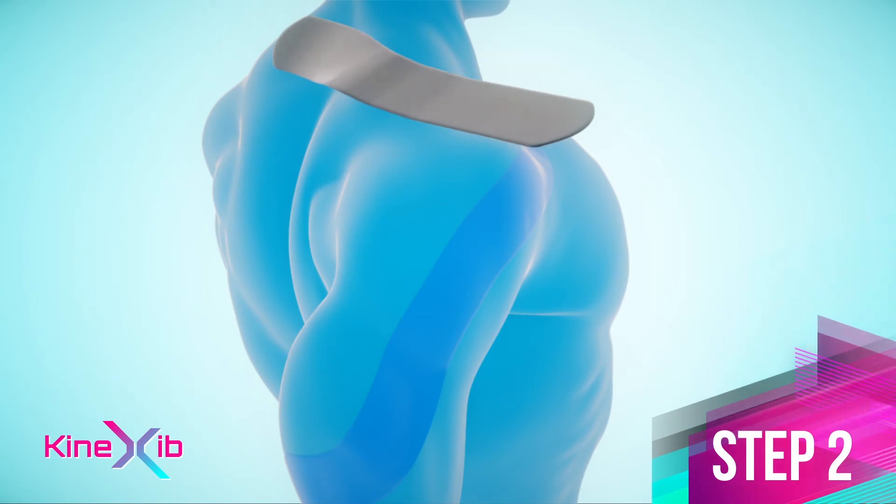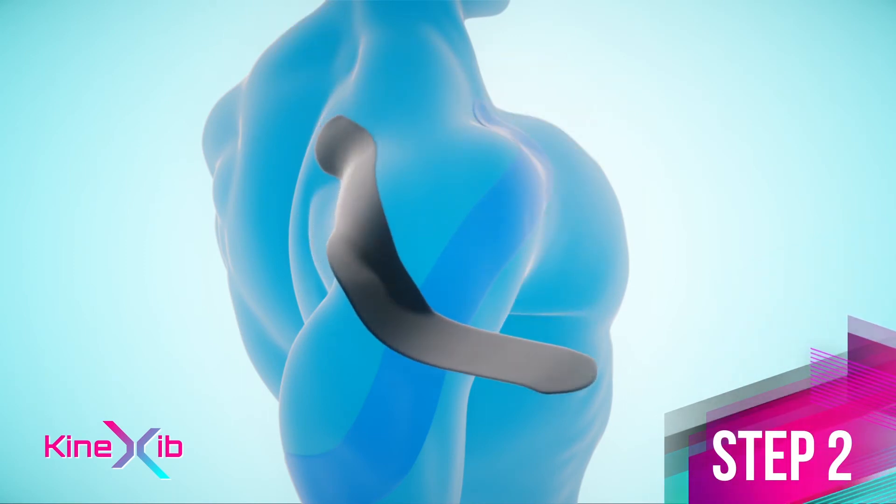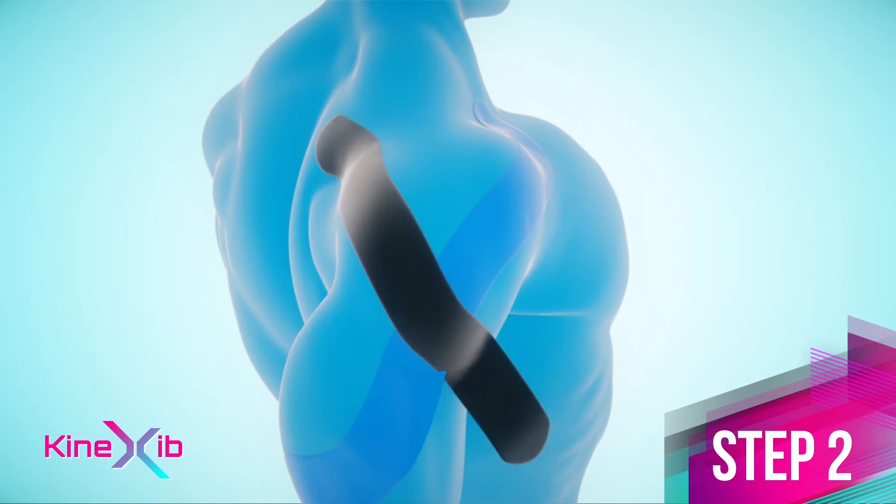Step 2. Stretch the muscles by placing your hand to the opposite back pocket. Anchor the second tape on the scapular spine. Then apply the tape on the back of the shoulder, pulling to the front of the shoulder towards the biceps with about 40% stretch. Then lay the distal anchor.